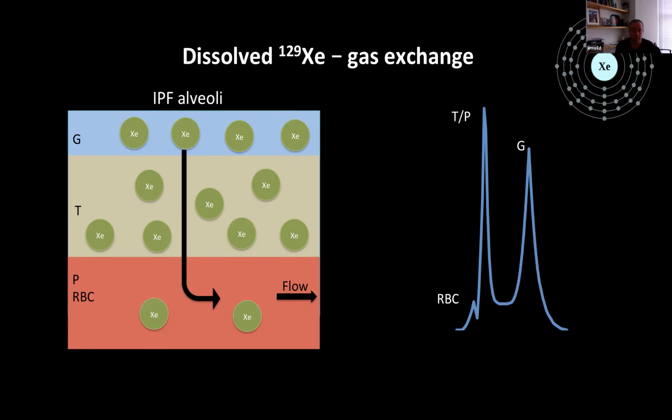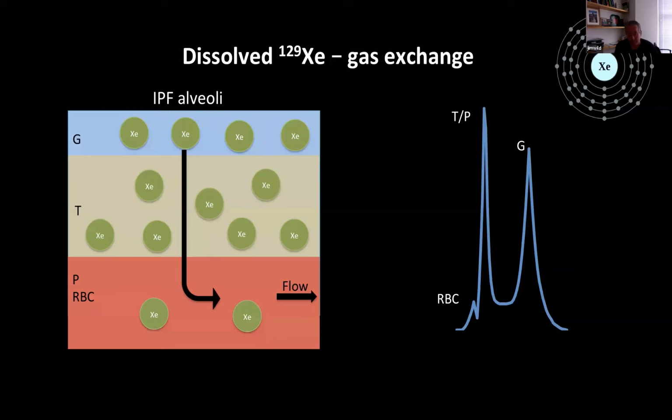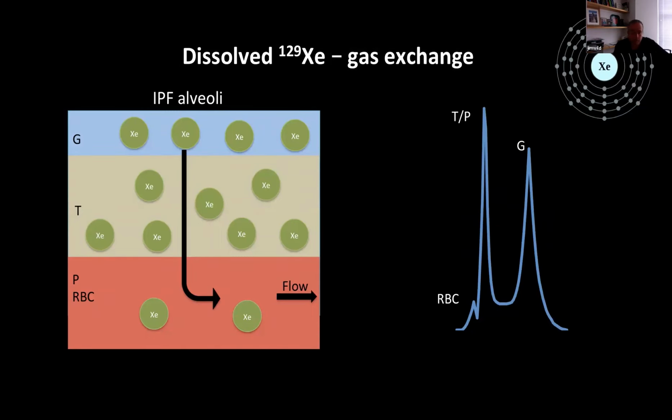So we've shown that method to be really sensitive in previous studies in IPF, where we can measure disease progression. So that's an obvious candidate for trying to understand the pathophysiology of COVID.